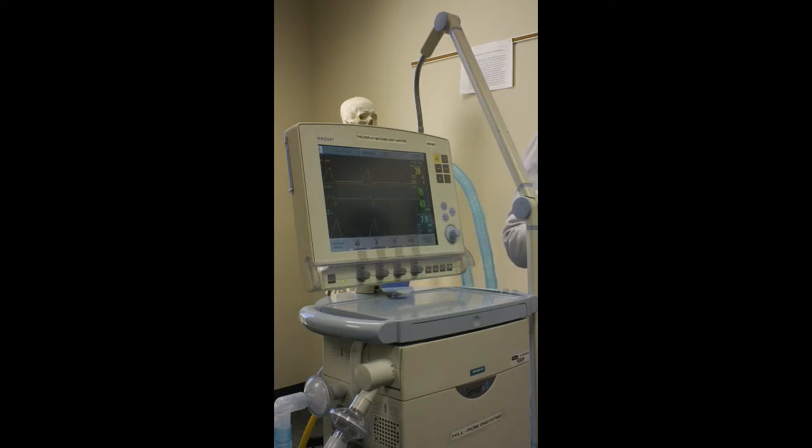PRVC, would you have something in here? Remember we talked about your limit, right? Pressure regulated volume. We're talking about volume right now, tidal volume. Yeah, you would. Your target tidal volume would go there.